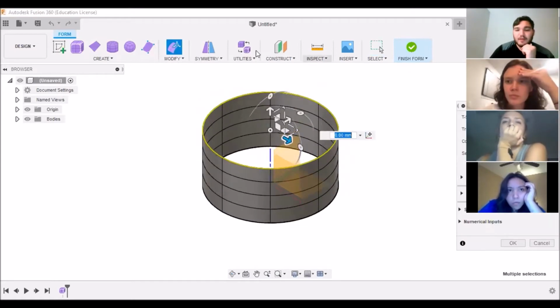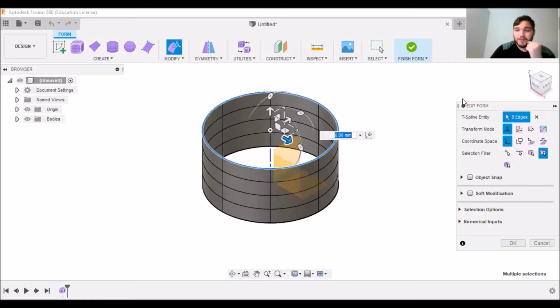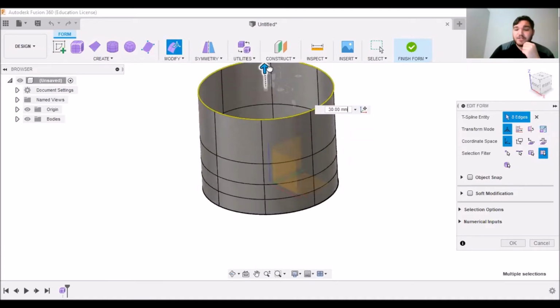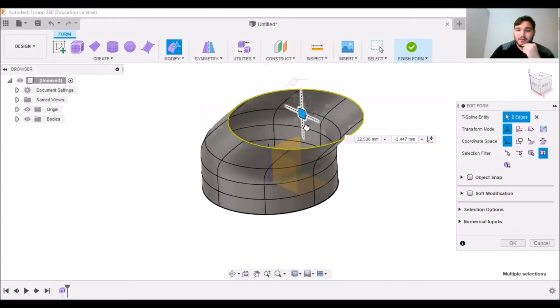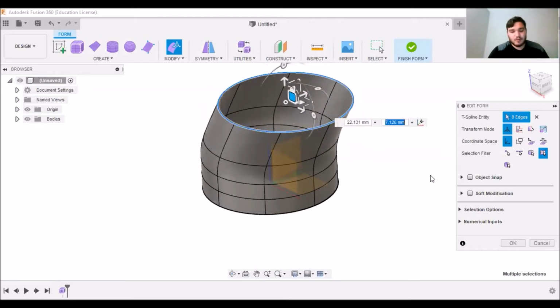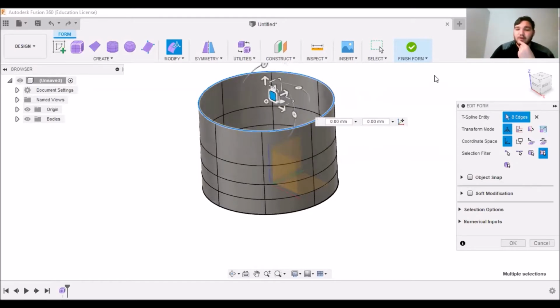And now we're given this weird funky set of random arrows and squares. That's actually super helpful, super important, because with this, we can drag to create a much taller cylinder. We can rotate it to make a twisty cylinder. Translate it. You can do a bunch of things. And so just for now, we can make it just a little bit taller and press OK.